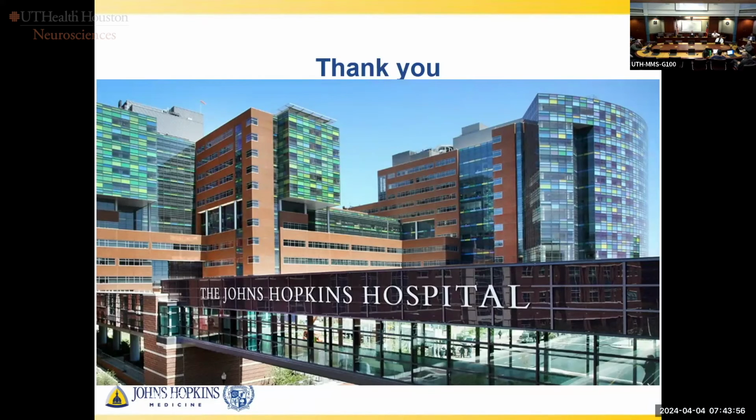Joe: I've always looked at the AR stuff, whenever it was pitched to me, as an extension of primarily navigation. Basically, it is a better and more ergonomic user interface for looking at it and then putting your screws in without having to look at another screen. But there is the cost of adoption. This is a really, really fast moving technology, obviously. And hopefully, within the next 2 or 3 years, you're going to see everything shrink down so it's just glasses. Why should someone adopt the technology now?